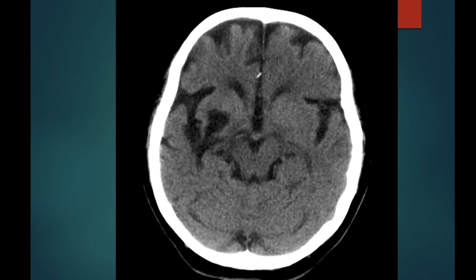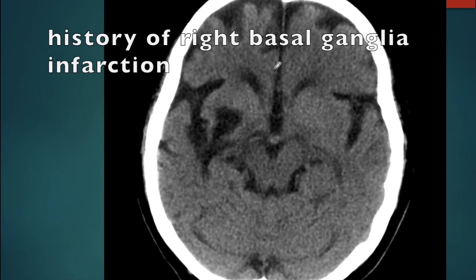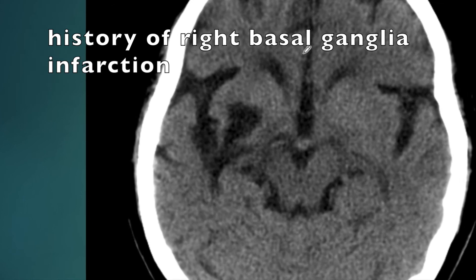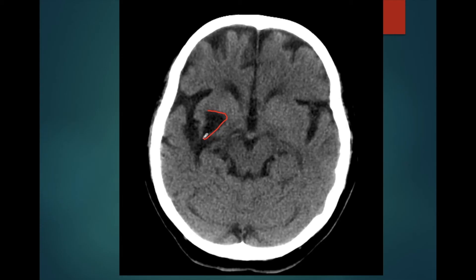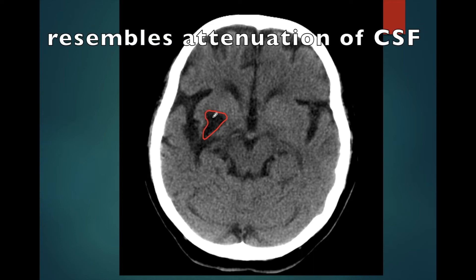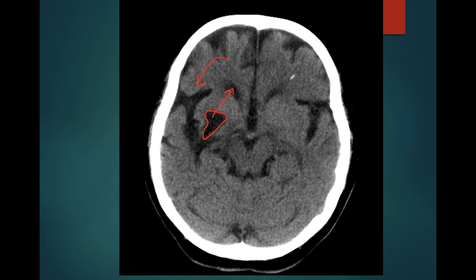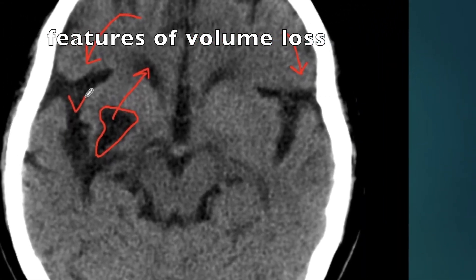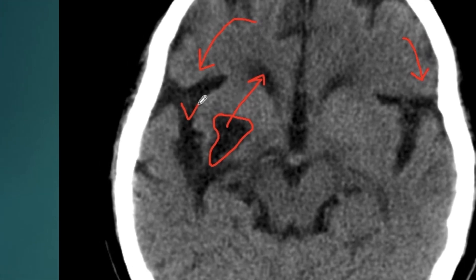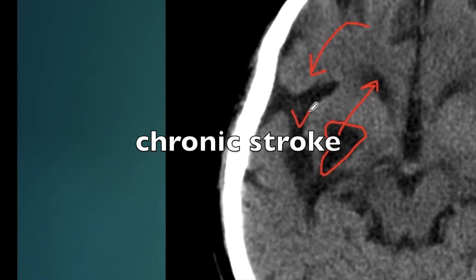In another case of a patient who previously presented with right basal ganglia infarction, the chronic changes are a hypodense area in the right basal ganglia that resembles the attenuation of CSF. Also, the adjacent sylvian fissure is prominent. Comparing the right sylvian fissure with the left sylvian fissure, the right sylvian fissure is quite prominent. These are all features of volume loss, and these features of volume loss are consistent with chronic stroke.